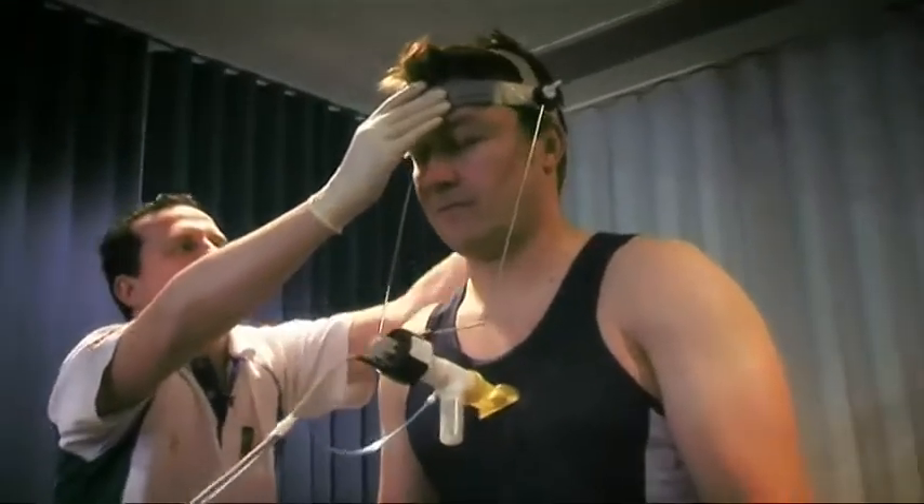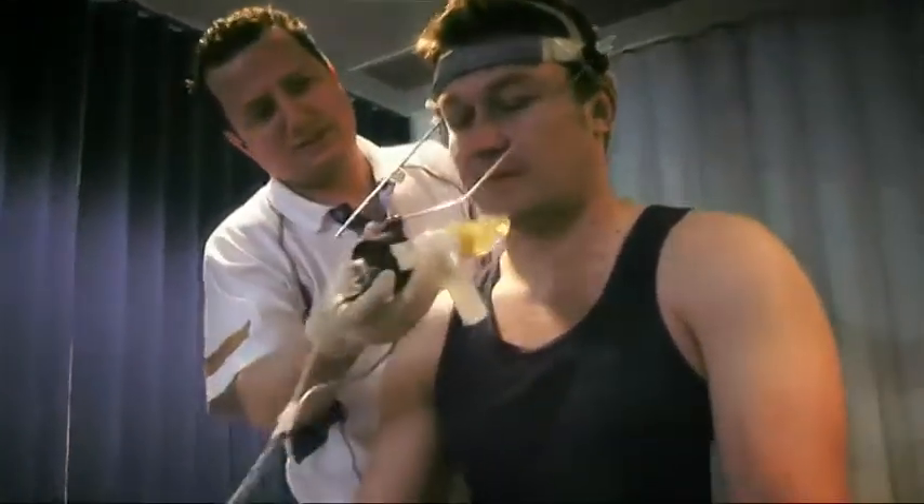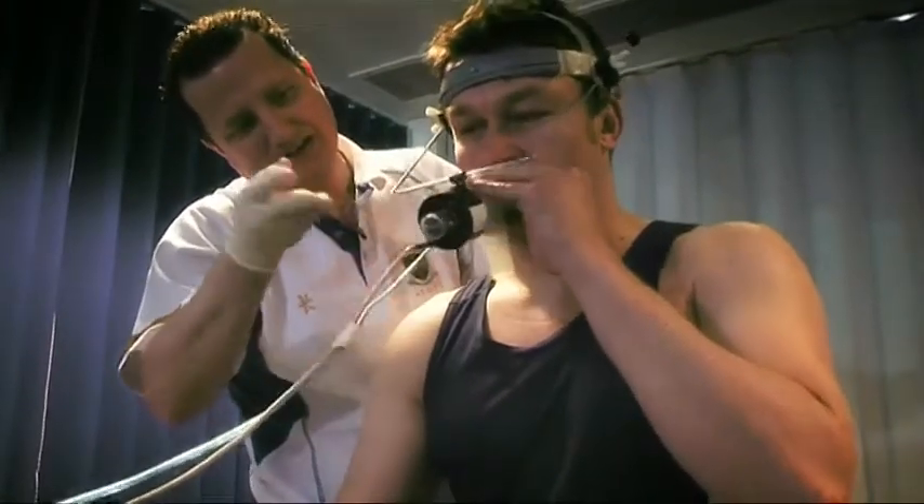The VO2 Max test is a test of maximal oxygen consumption and it's a test that we use to assess aerobic fitness or endurance fitness.